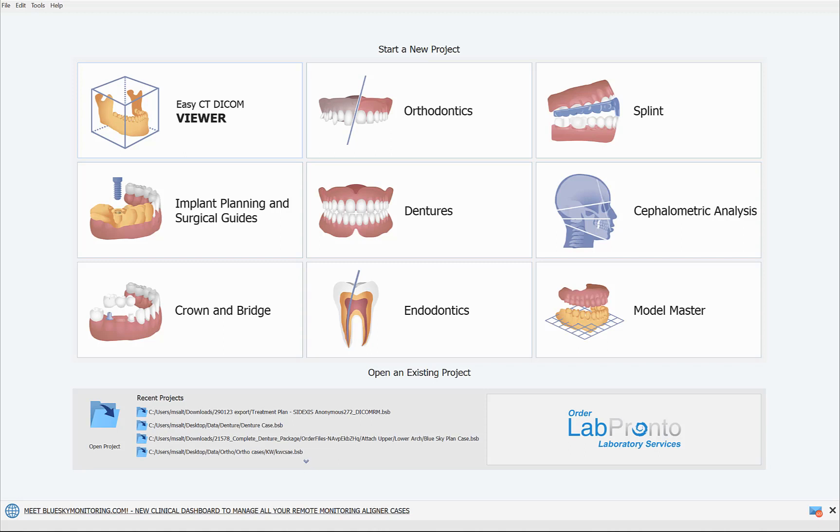Hello everyone, this is Michael from Blue Sky Bio. I'm very excited to announce that we're going to be rolling out version 4.10 of the Blue Sky Plan software, and that is what you see on the screen in front of me.